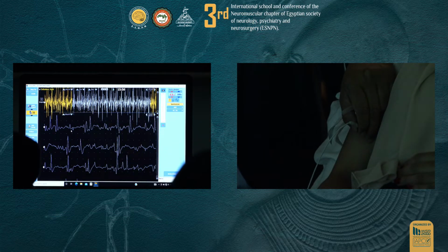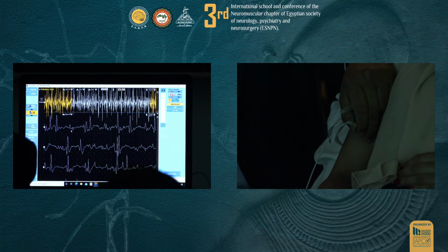So you have recorded multiple motor units here. I'm going to show you some different motor units. How do you calculate the number of phases? It's the number of baseline crossings plus one. It crosses the line once, twice, and then back. So this has 3 phases: 1 crossing, 2 crossings, plus 1. So there's 1 phase, 2 phases, and 3 phases.